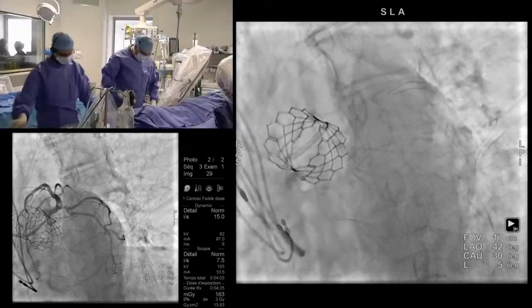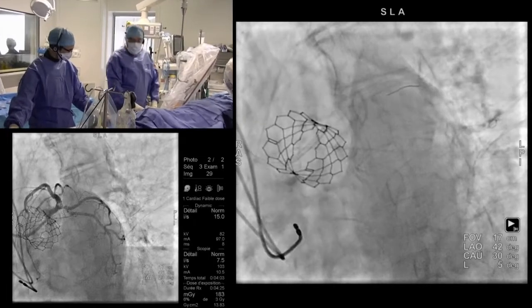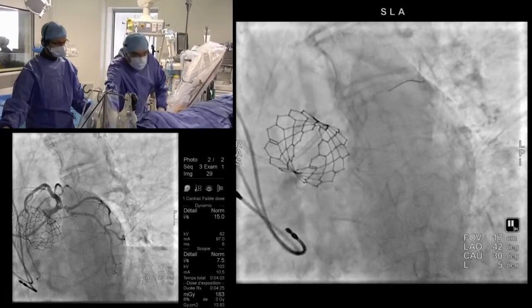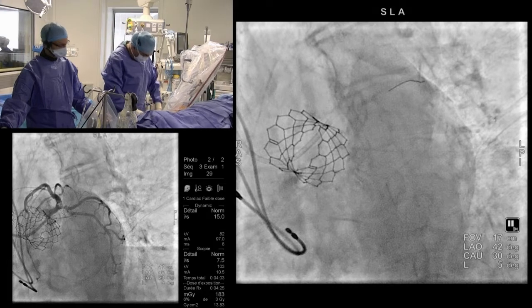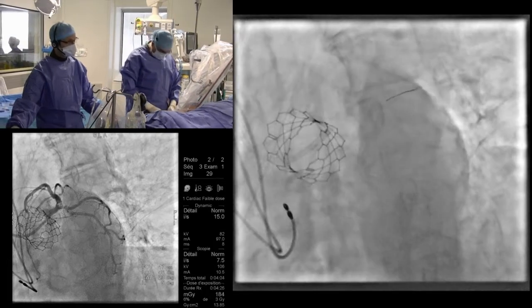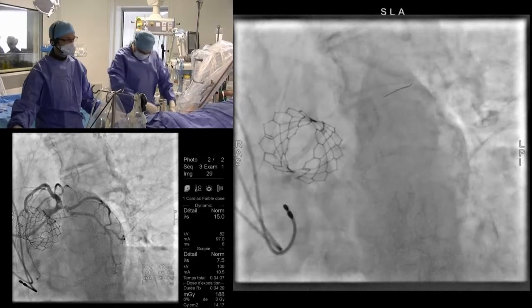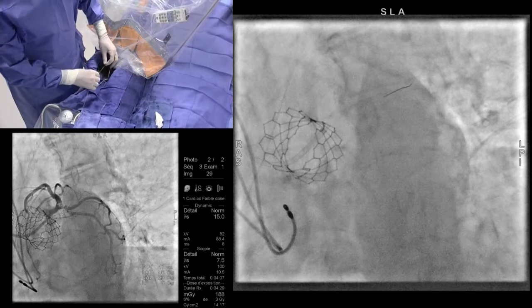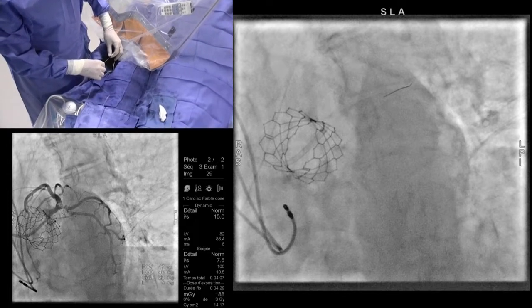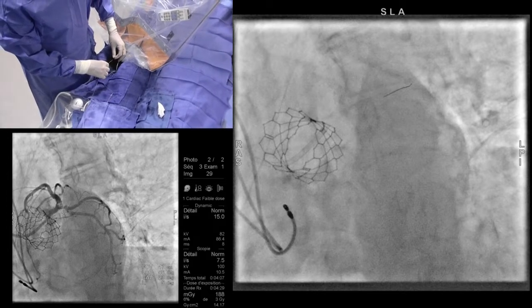So, unbelievable case. I think incredibly complex. Of course, you would have different solutions to do that. I think you have an incredible case, and obviously very, very difficult. Both huge branches are severely calcified, probably need rotational atherectomy on both sides. So, we have a great panel. Anybody have any comments, any questions?